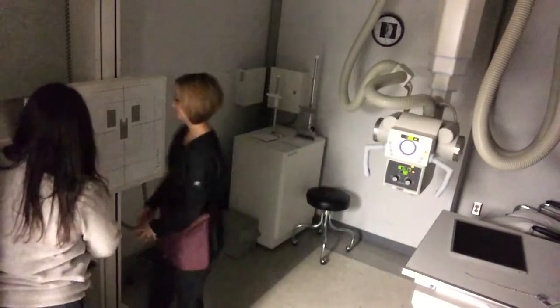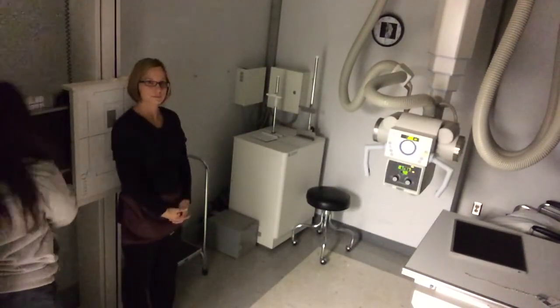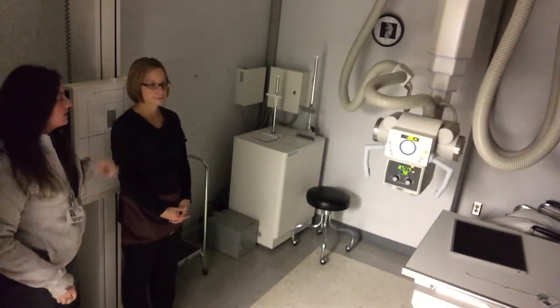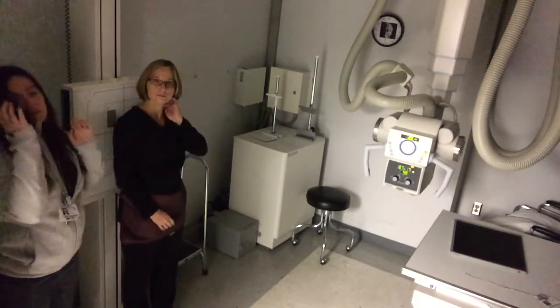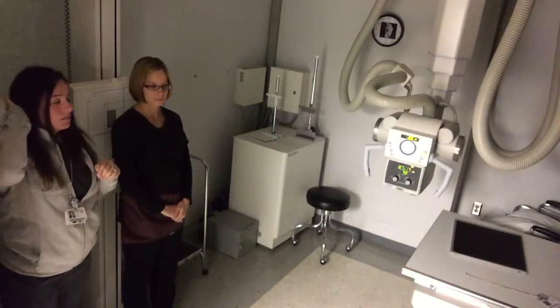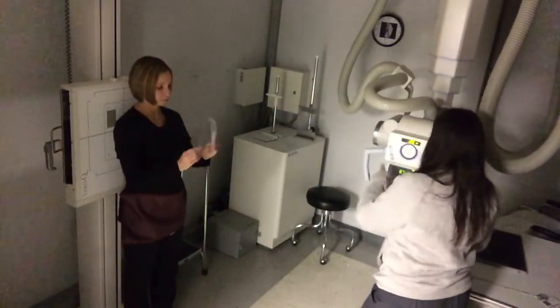12. When you are prepping your patient for this exam, you'll be wanting to have them take off any earrings, eyeglasses, necklaces, even hair ties, hairpins, and anything that might show up right behind their C1 on the open mouth. So those are the things you'll have to look out for.